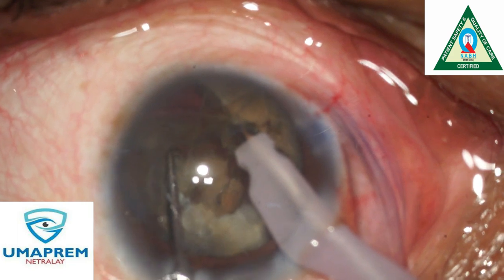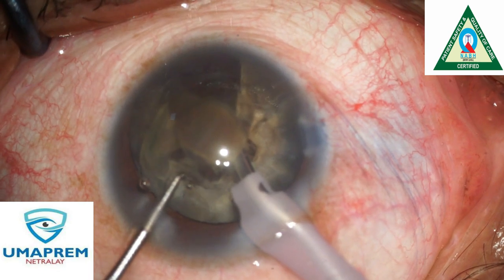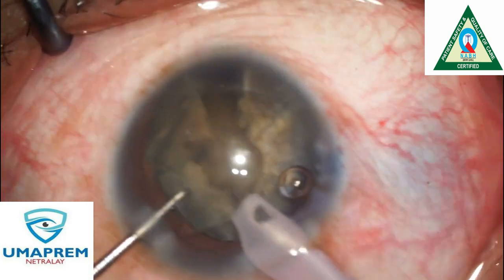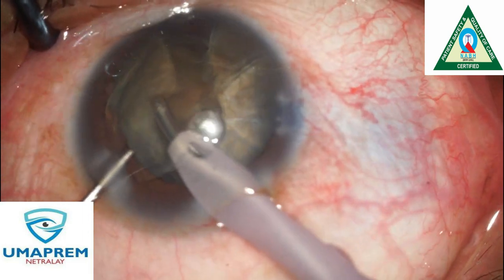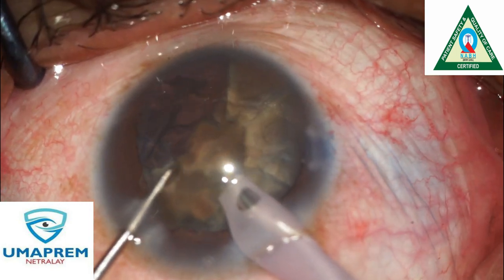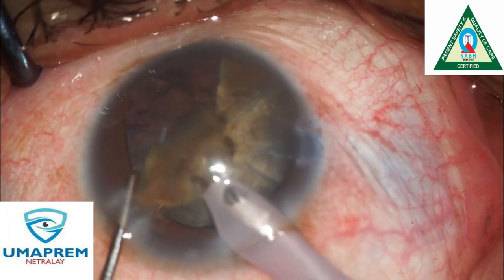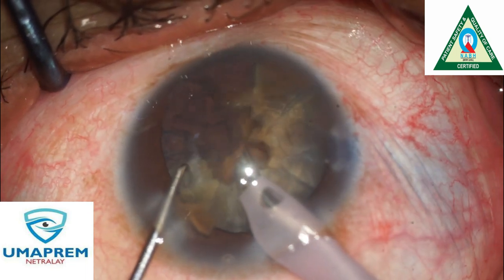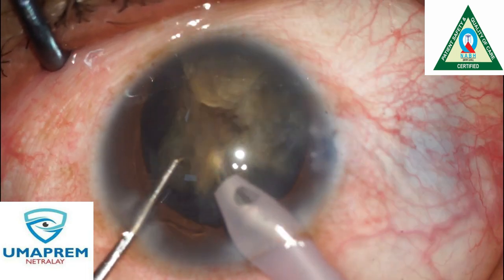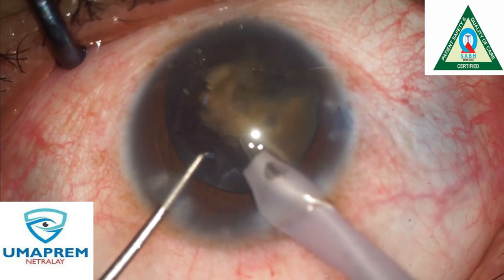We start emulsification. We generally use a viscodispersive agent to protect the corneal endothelium, because this is a one-eyed patient. See the beauty of this machine — the emulsification starts in a very controlled manner in this one-eyed colobomatous patient. We perform emulsification away from the cornea, under the viscoelastic.